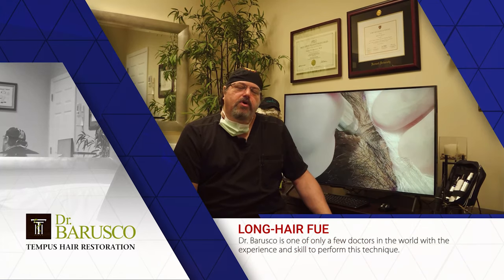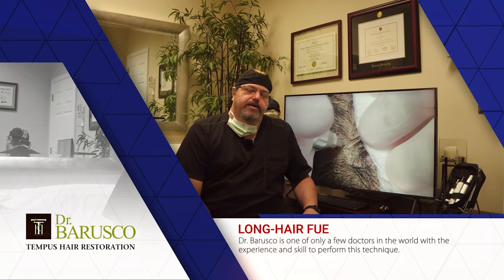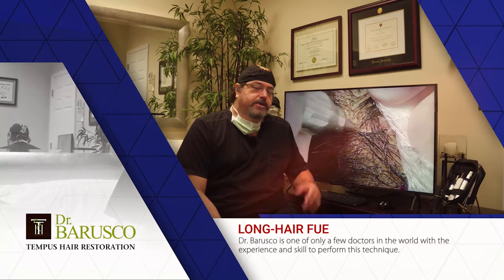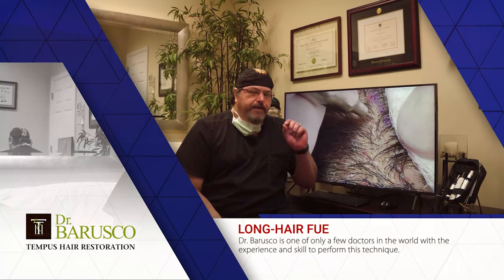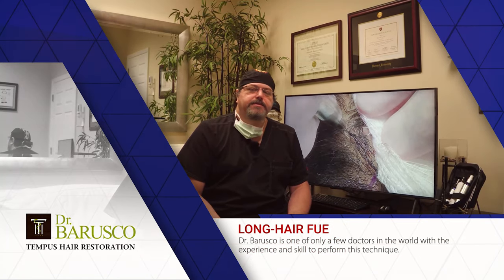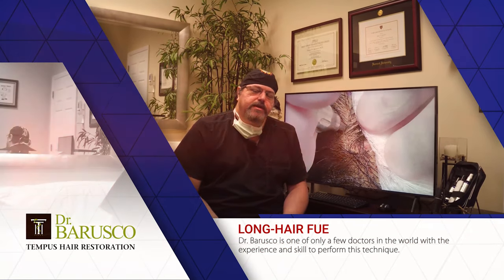Then there's a third variant called the long hair or preview long hair FUE. It was pioneered by my good friend Dr. Marcelo Pichon from Brazil — he popularized the method of long hair transplant with a strip method a few years ago. Nowadays, with advances in machines and equipment, we're able to harvest hairs via FUE while maintaining the hair shaft at its original length — sometimes one or two inches — and keep that length intact rather than clipping it short.